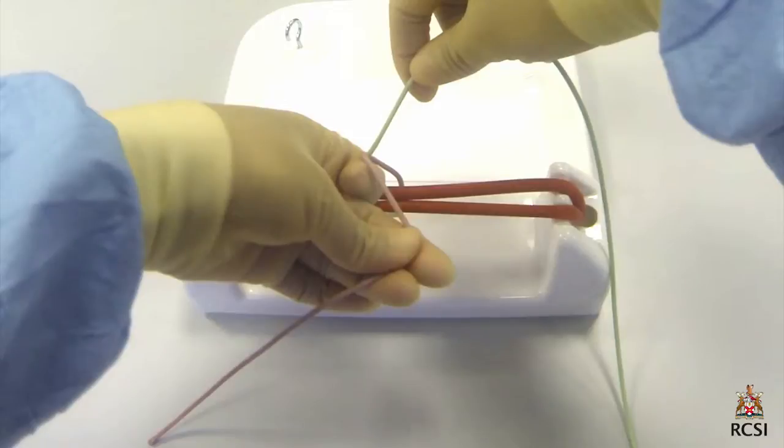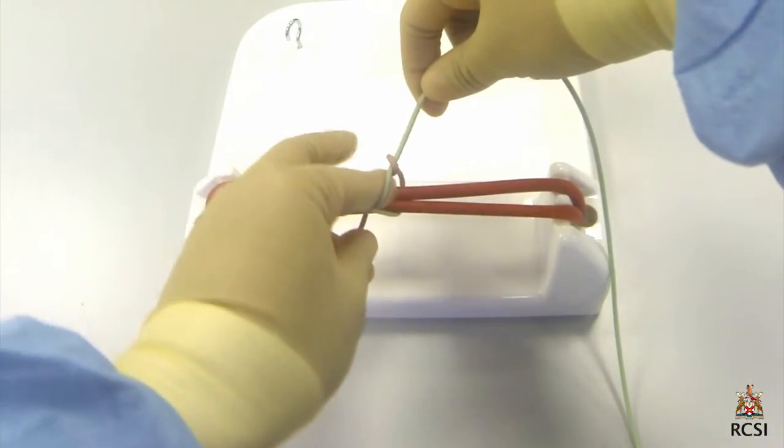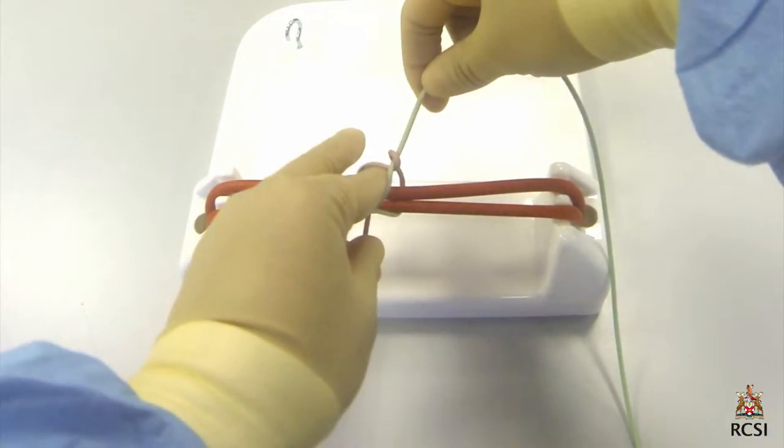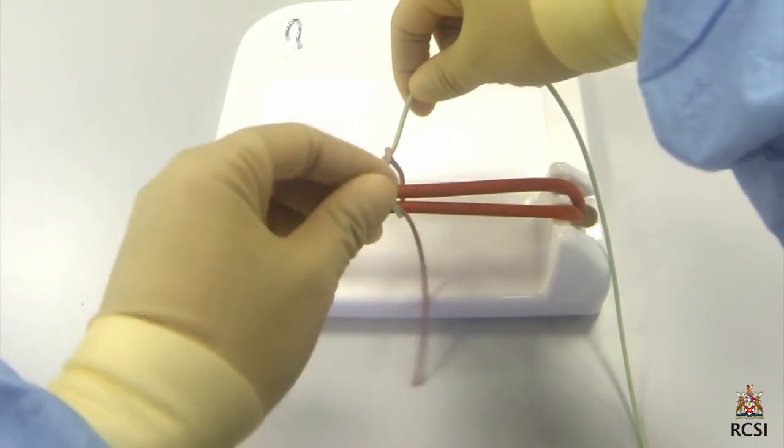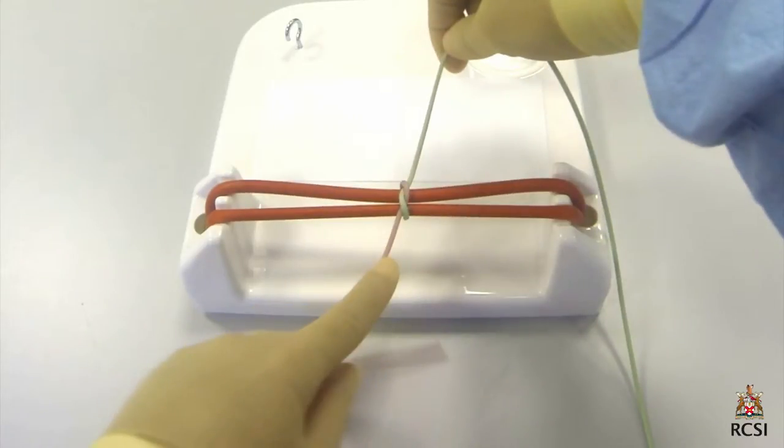The index finger then flexes, pulling the green rope laterally. Once the back of the nail reaches the pink rope, it extends and flicks the pink rope through the loop. Once the pink rope is outside the loop, the middle finger adducts against the index finger to hold the rope and pull it out of the loop. The knot is tightened by pulling both ends at 180 degrees to each other — this straight configuration is referred to as a square knot.